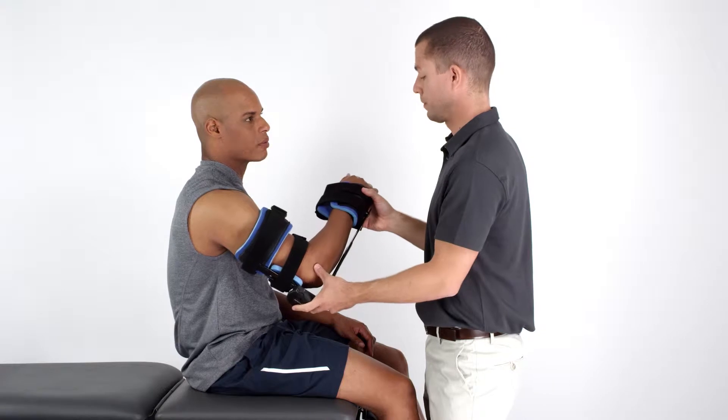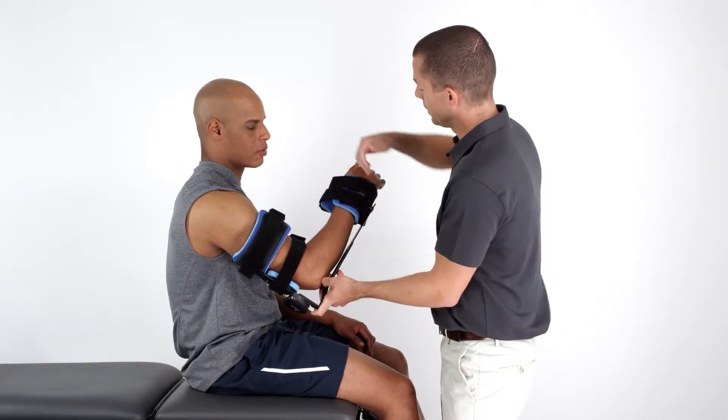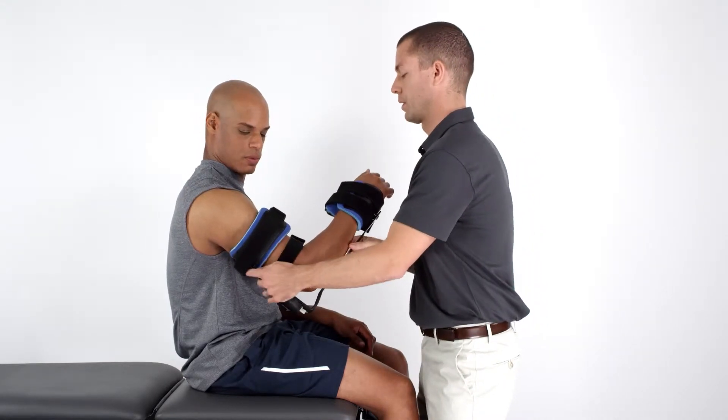Adjust the distal cuff to a length that positions the hand properly within the cuff. The proximal strut should not impinge on the medial axillary area.